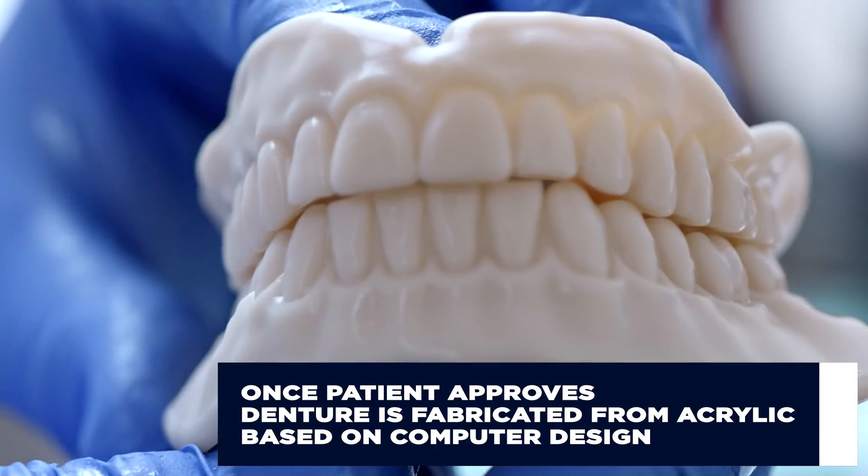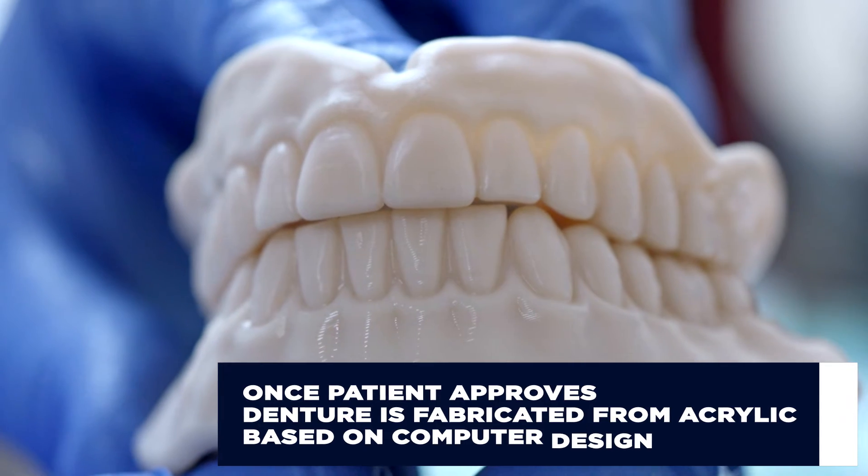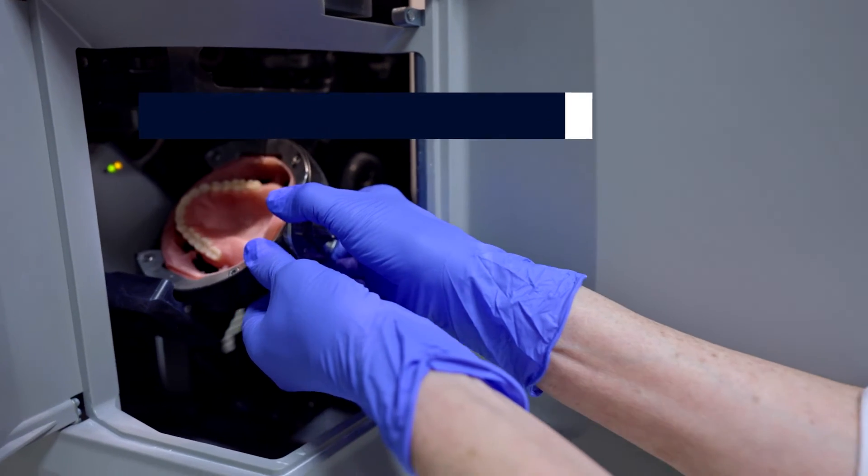If the clinician and the patient like the aesthetics and the function, then we can, with the push of a button, fabricate the final denture that is milled from a pre-polymerized block of dense and strong acrylic. Cutting instruments remove whatever doesn't belong so that they can create the final denture based on the computer-aided design software.